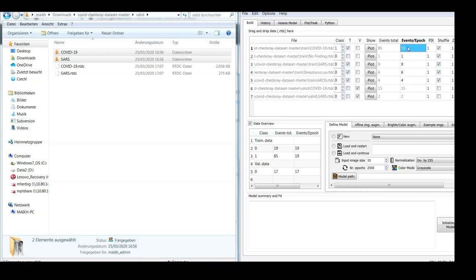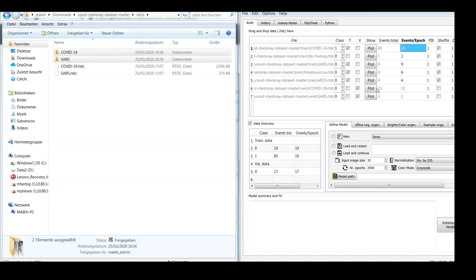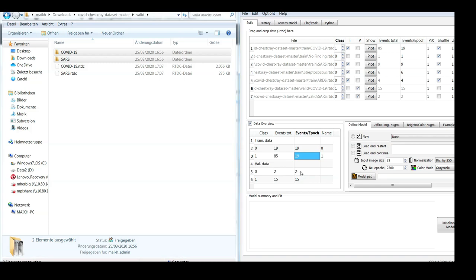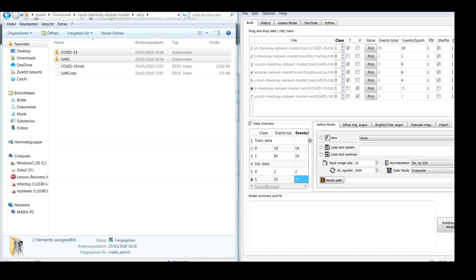Because here in this case, it could happen that if I trained using all the 85 images versus the other 19 images, the model could find a trivial solution, which is to figure out that COVID-19 images are predicted correctly. Only those two here that are SARS, and in the validation set we actually have a class imbalance because we have only two images for SARS versus 15 for COVID-19.